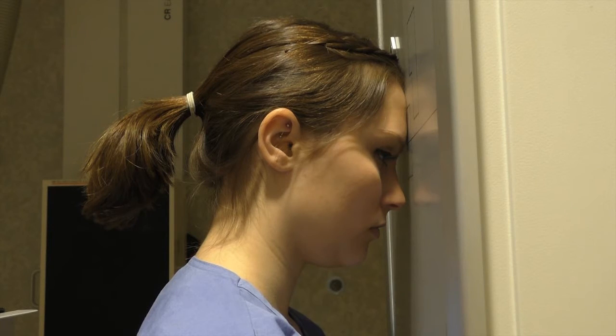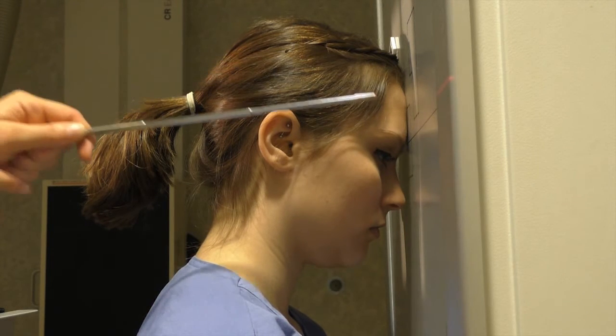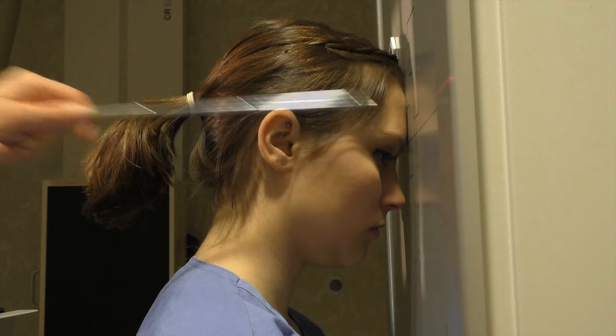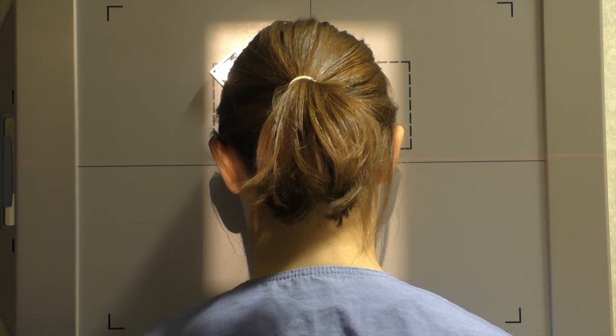For the Caldwell method, there should be a 15-degree caudal tube angle. The nose and forehead are placed against the board. To ensure no tilt or rotation, the OML is perpendicular to the IR. Center at the nasion, collimate around the area of interest. Marker is placed on the correct anatomical side. Suspend respiration. And the mid-sagittal plane is perpendicular to the IR.